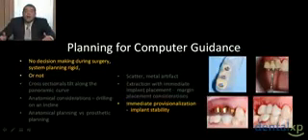How about immediate provisionalization? Well, we can plan for immediate provisionalization, but ultimately, the final decision-making, whether or not we can immediately load or provisionalize that implant, is going to be based upon implant stability. So just because we planned it on the CT and done all our homework doesn't mean we can always definitively follow through that plan.